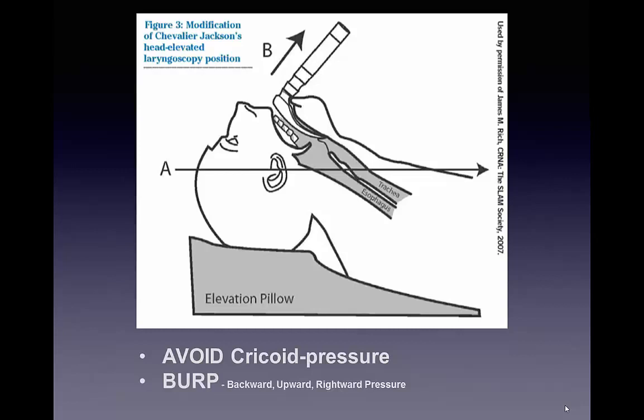Now you're ready to insert the actual laryngoscope into the patient's mouth. At this point, the laryngoscope blade is introduced into the mouth with gentle, slow movement.